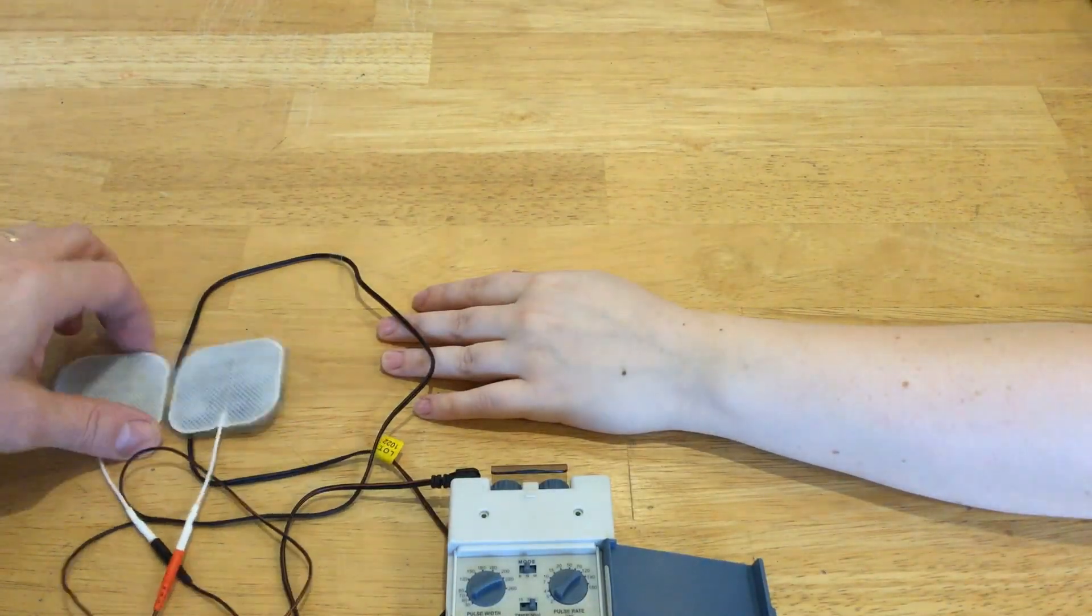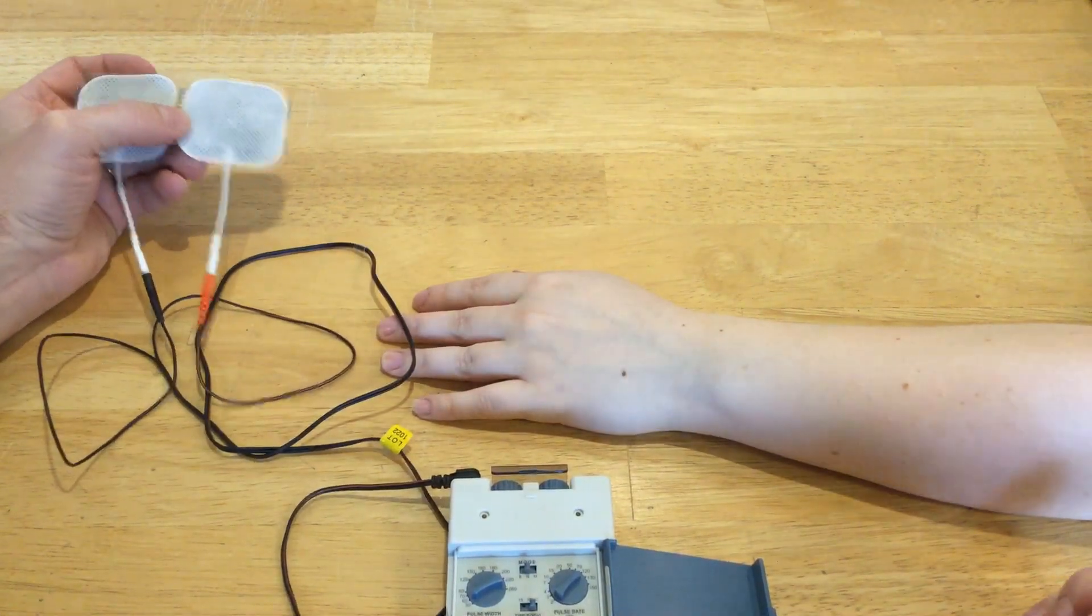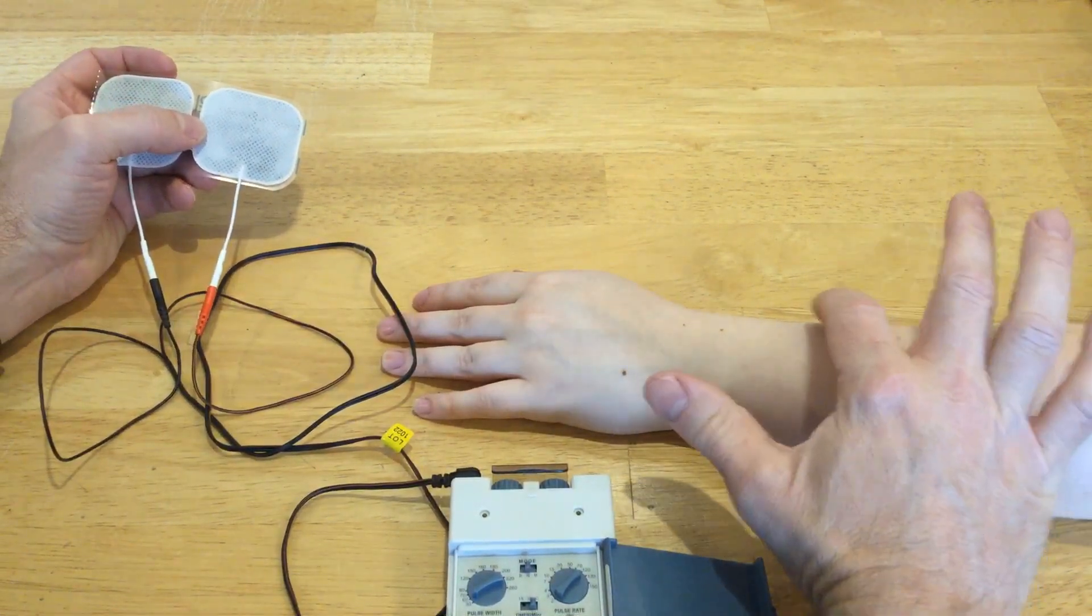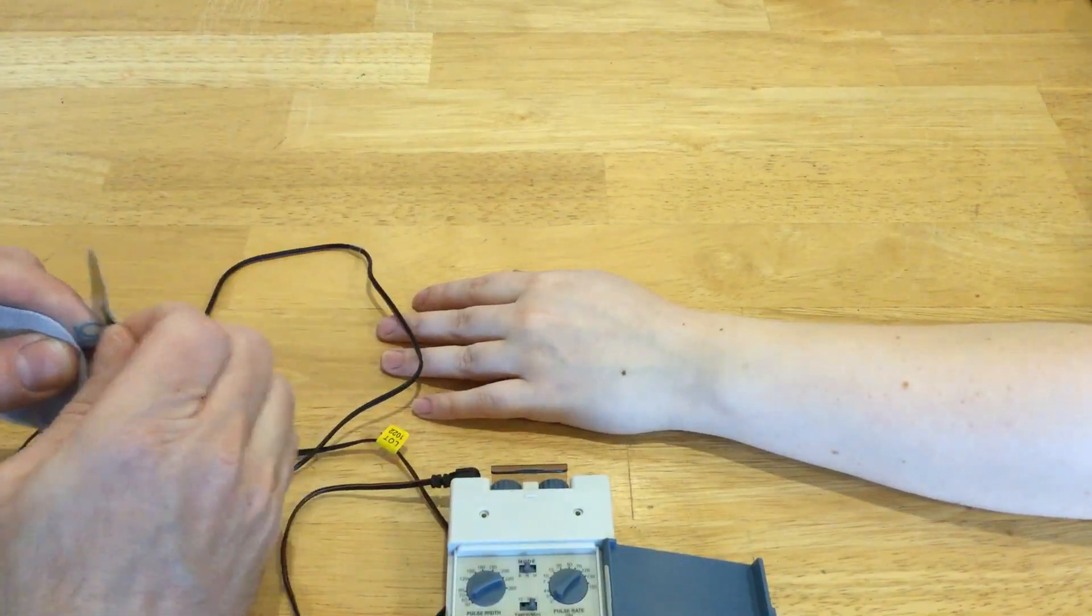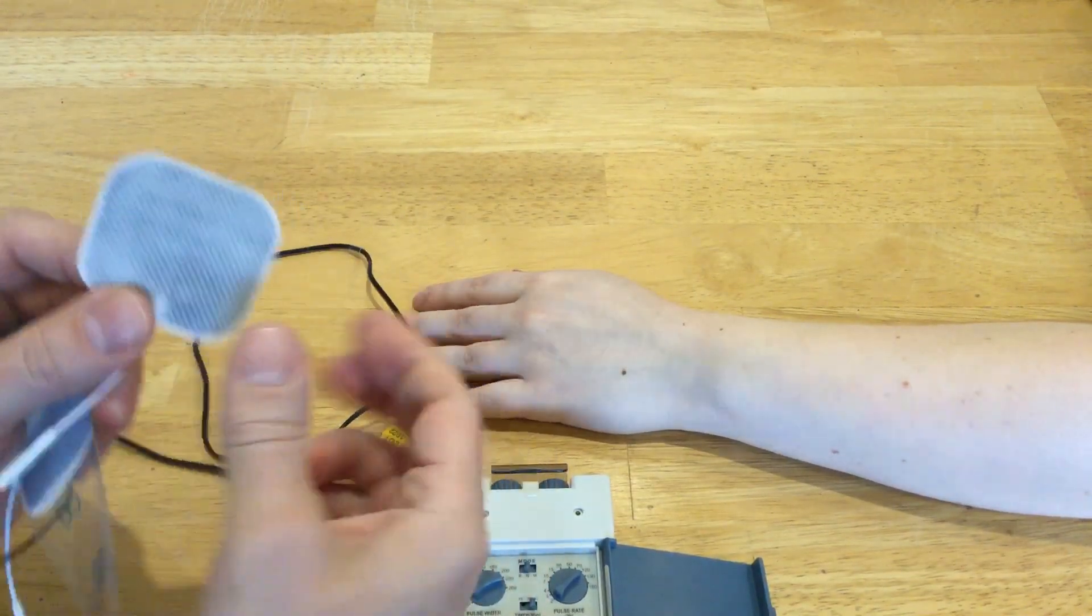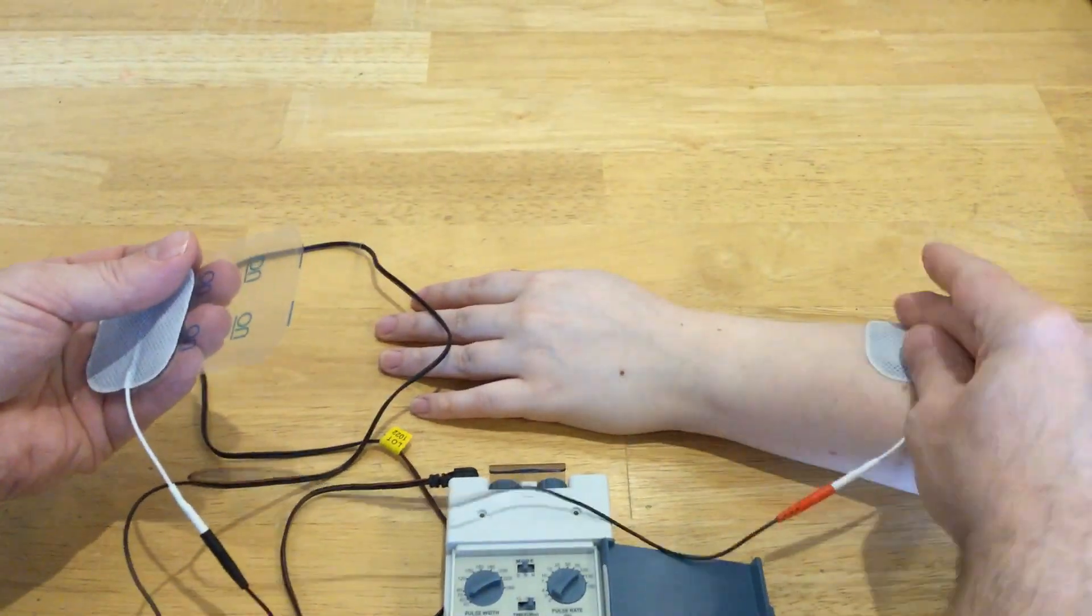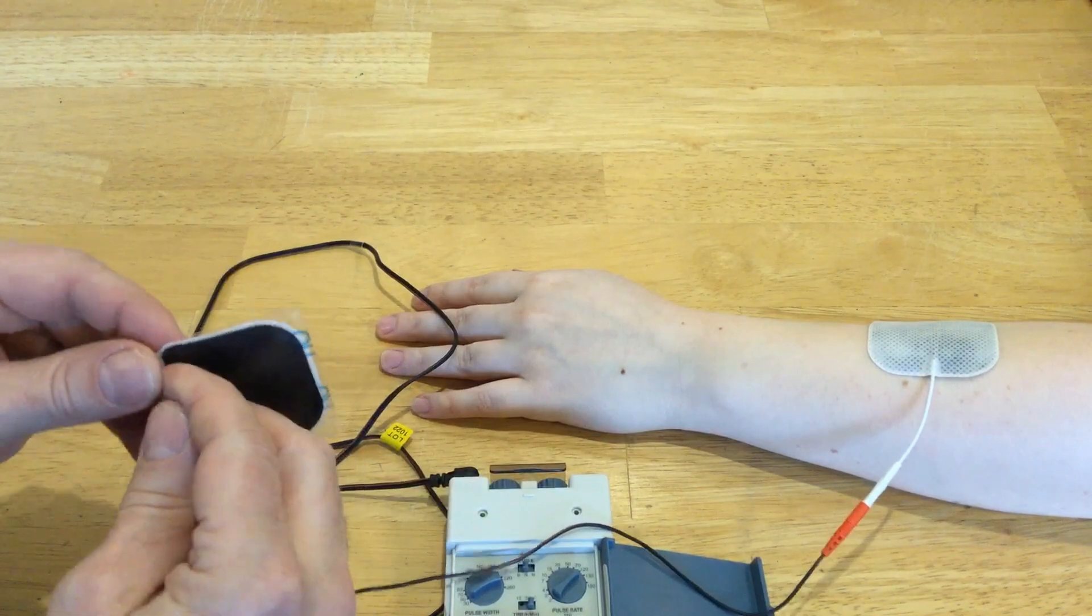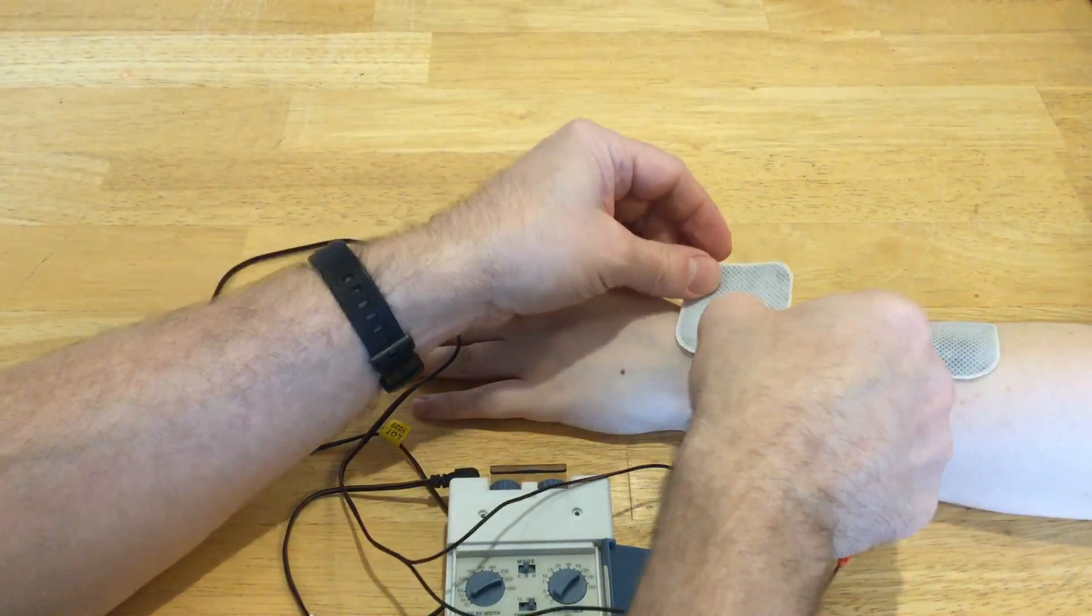Once we've done that, I'm going to pretend that my client has intersection syndrome, which would be pain right in this area here. Basically, you want to surround the area of pain with your electrodes with conventional TENS. So I'm going to apply an electrode proximal and an electrode distal.